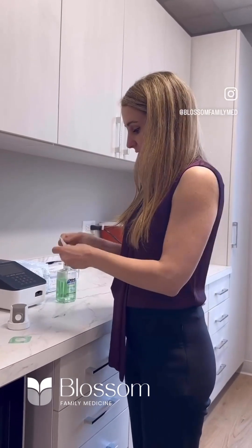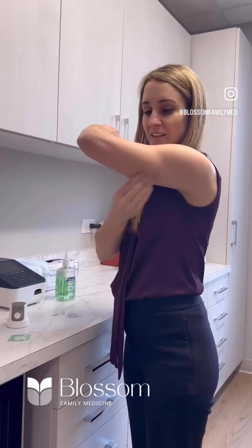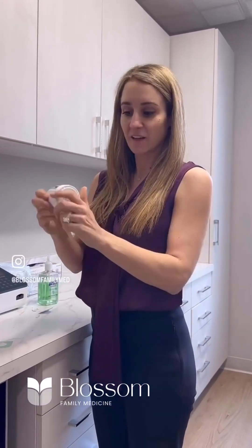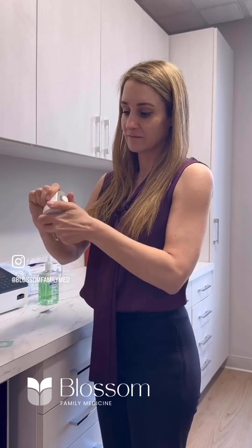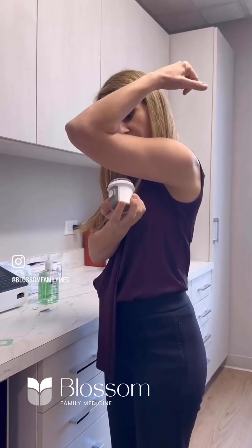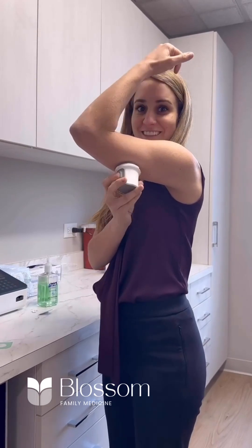You clean your hands, mark the spot where you're going to put it — right behind the arm — and then you check what it looks like. Then you go 90 degrees and push the button to release it.